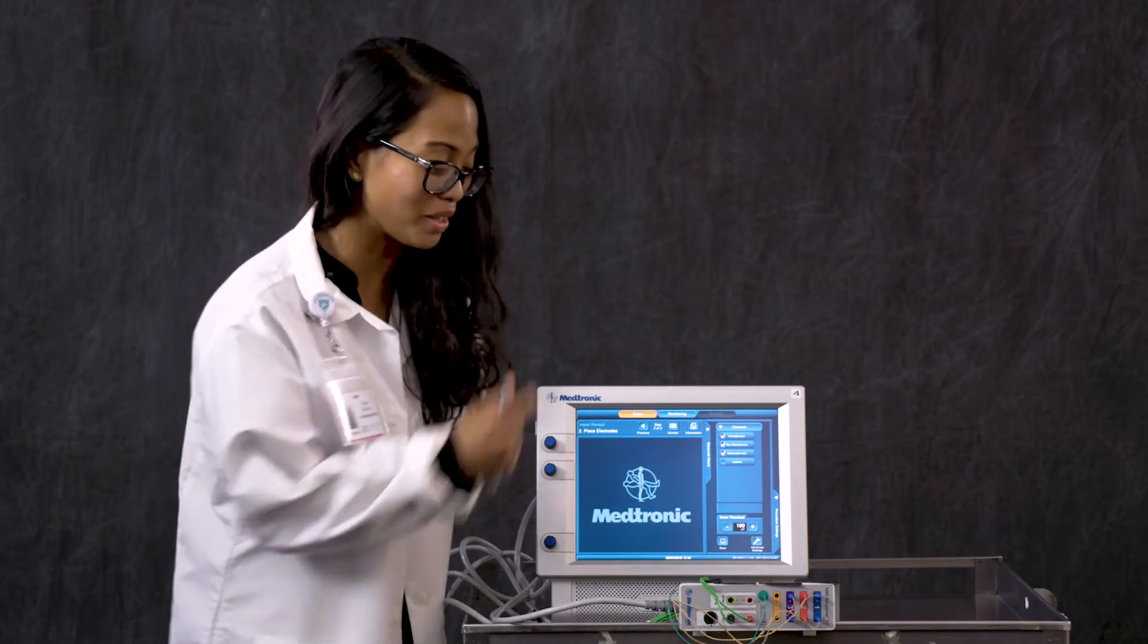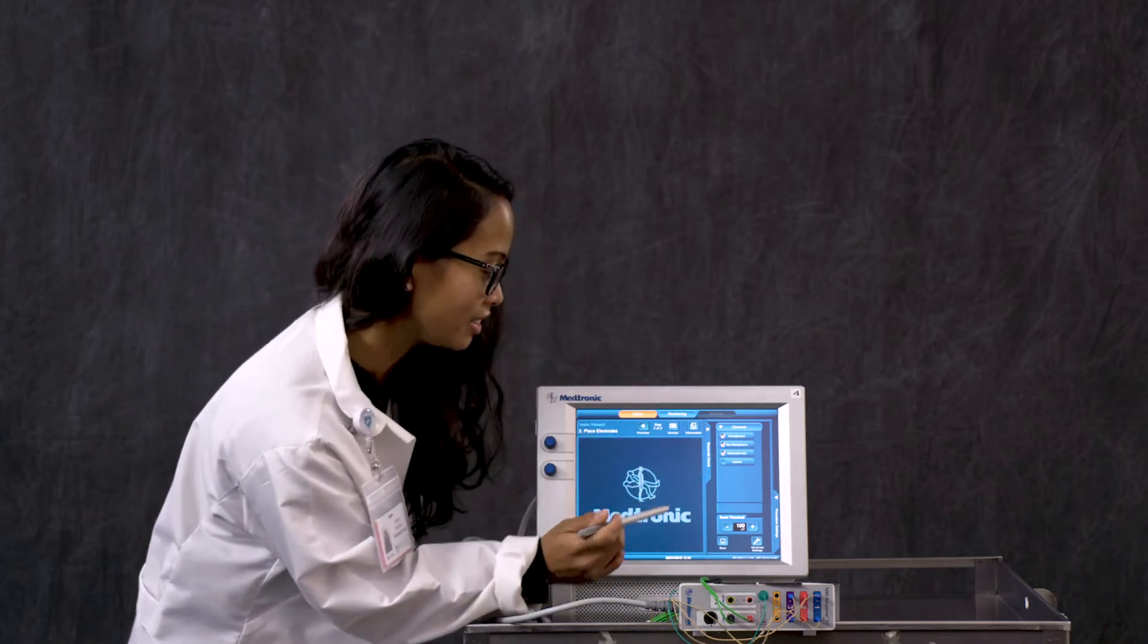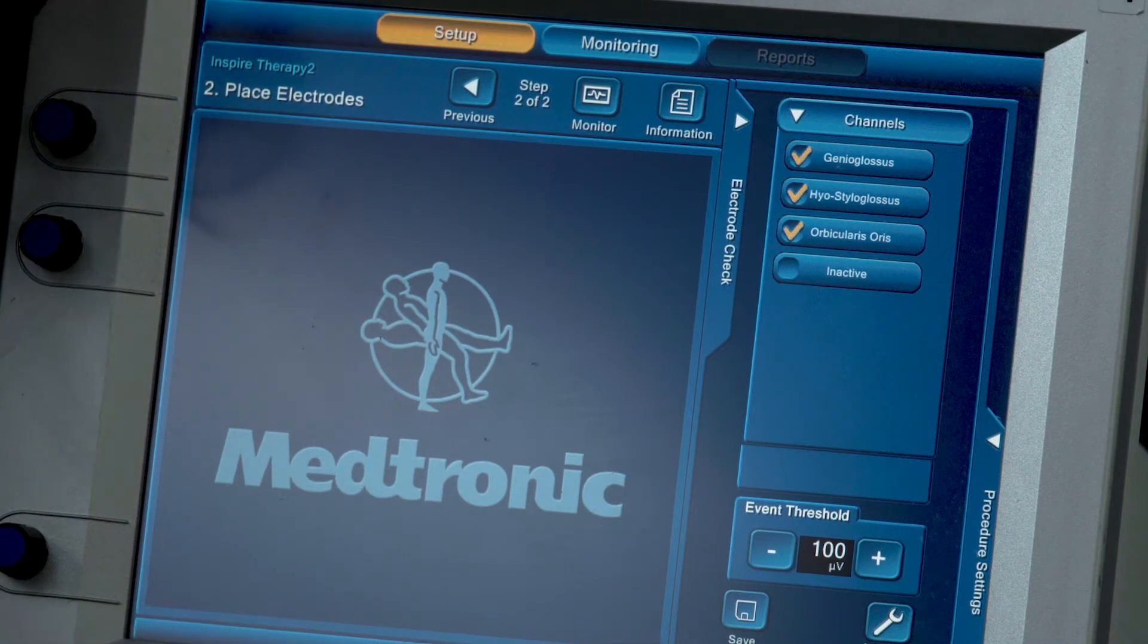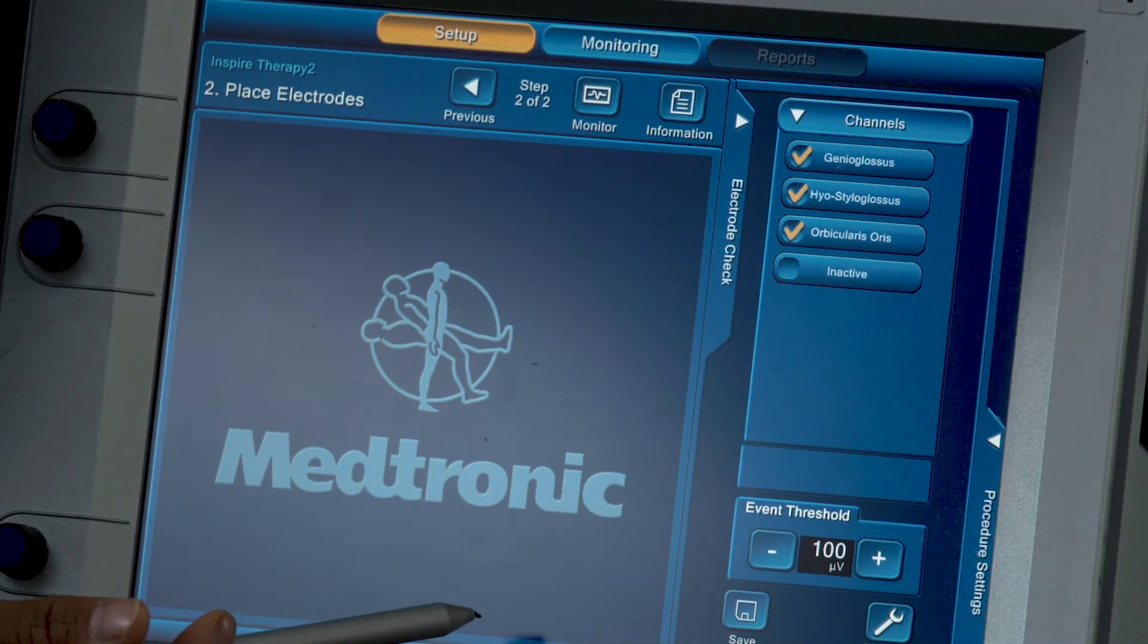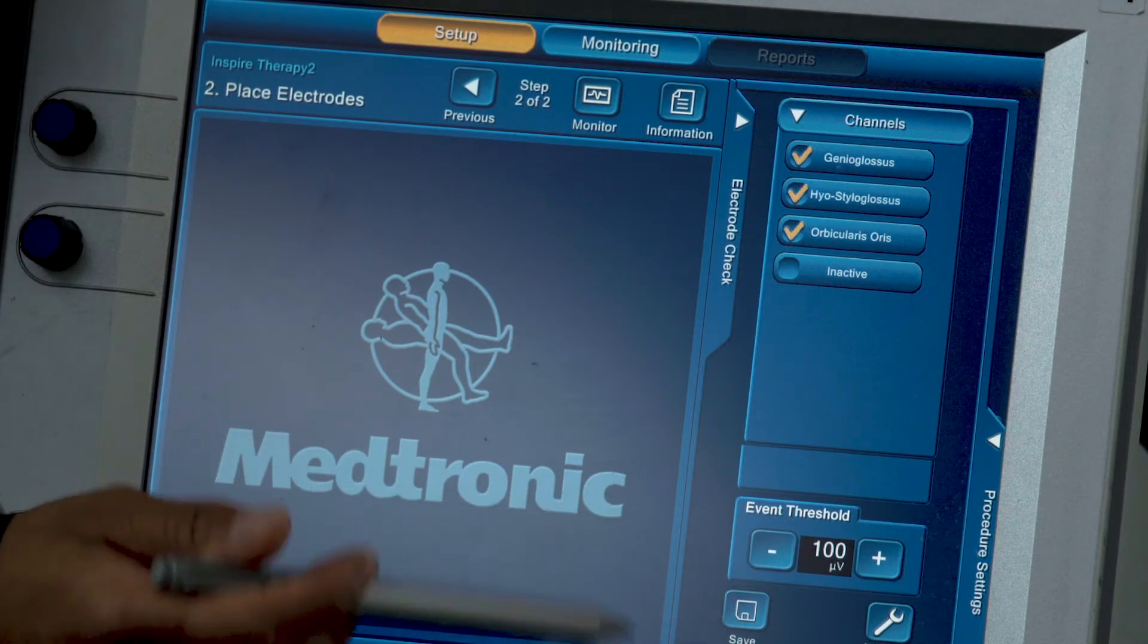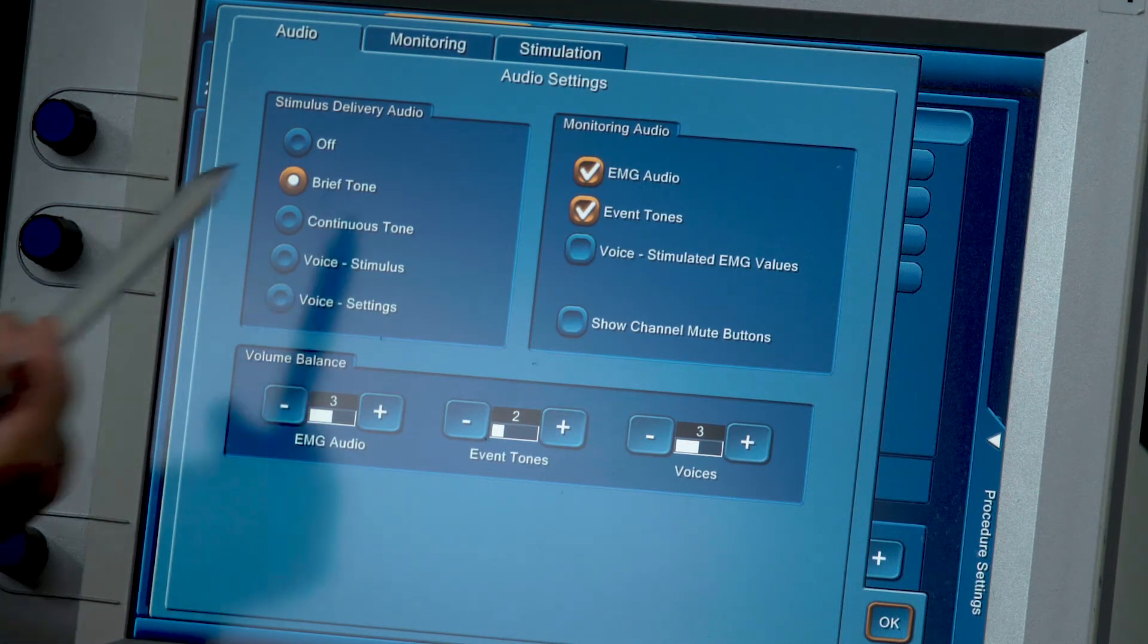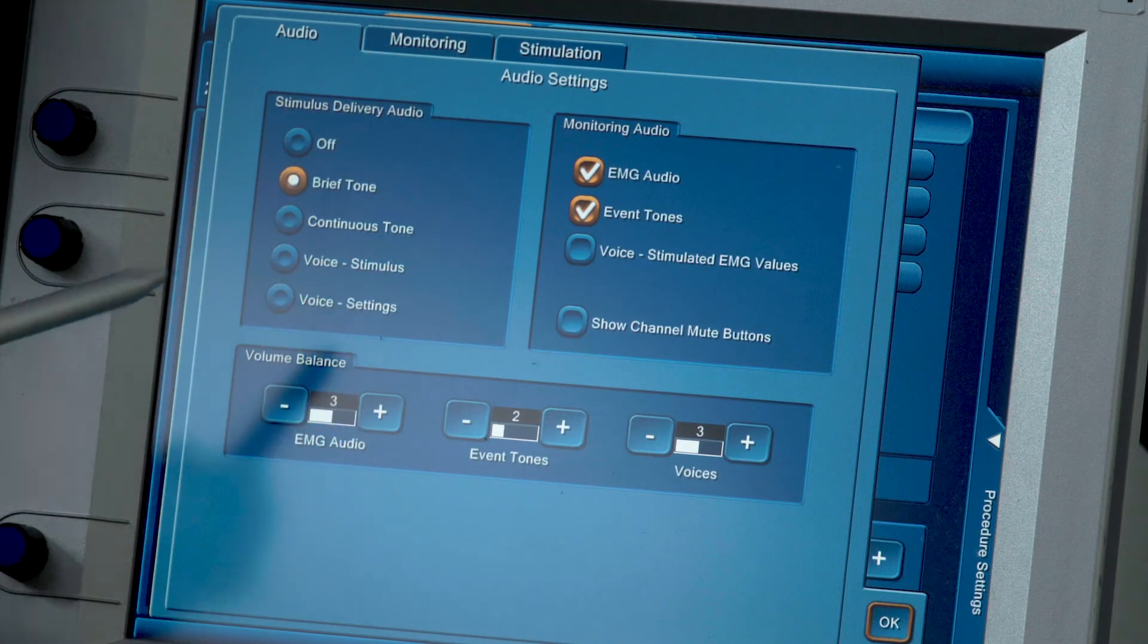So now we are going to move on. We've made our three channels, we've looked at our event threshold which is at 100 microvolts, and we saved it. We are going to our advanced settings. This portion is very important when creating the template. You've got three tabs: audio tab, monitoring tab, and stimulation tab.